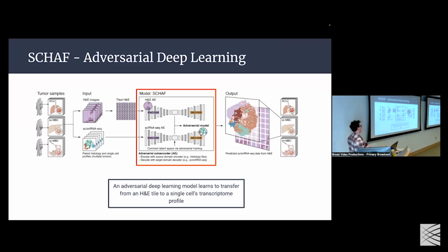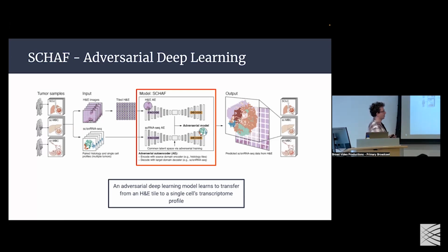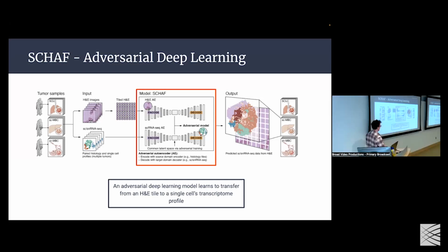And we are going to leverage the framework that John mentioned from Caroline Uhler's lab to learn a common latent representation of these two modalities. So we're going to learn two autoencoders, the first of which is going to take in H&E tiles, each representing roughly a cell, and encode and then decode, very straightforward. You have another autoencoder that's going to do the same thing with the single cell data, encode and decode. And the caveat here is that they encode to the same latent space.